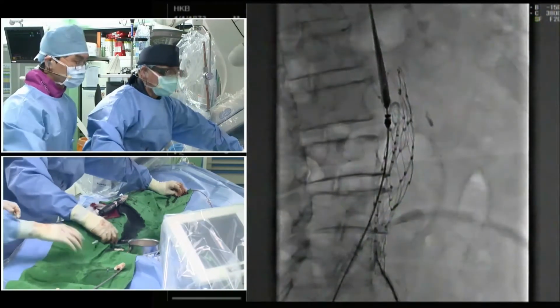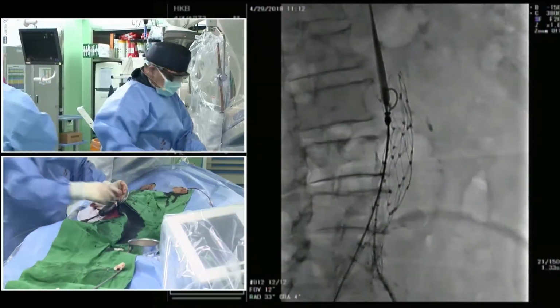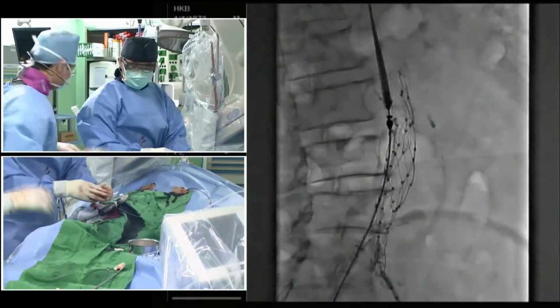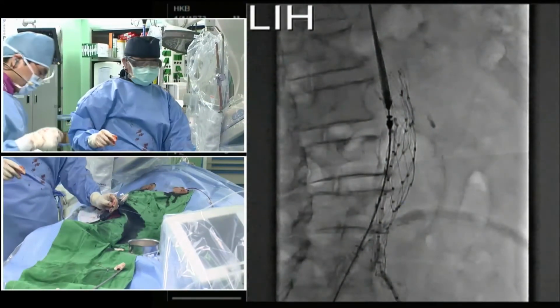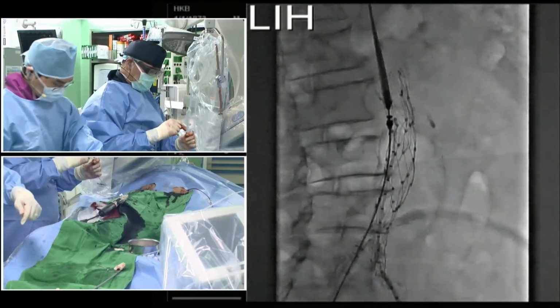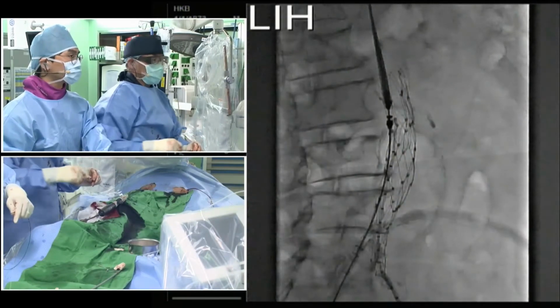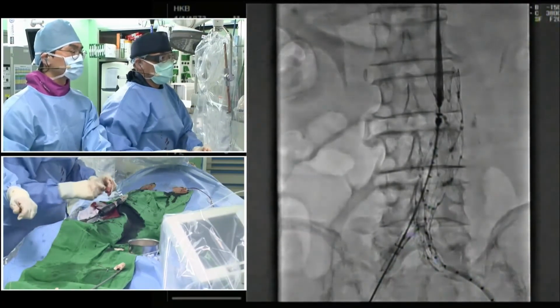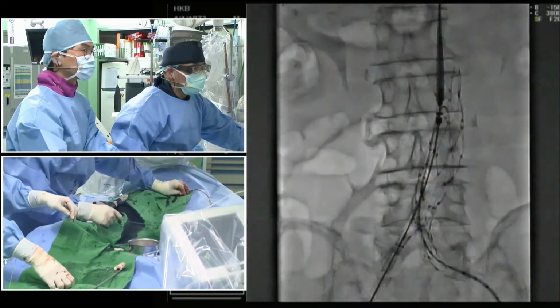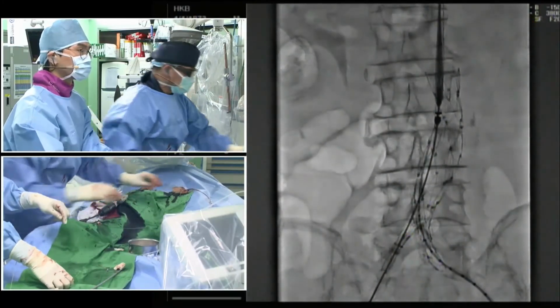Okay. Now detached. Yeah. Okay. Fine. So the pigtail looked like it clearly went outside the shadow of the frame, huh? Is it outside? Yes. Actually, not outside. It looked like it deviated way out.